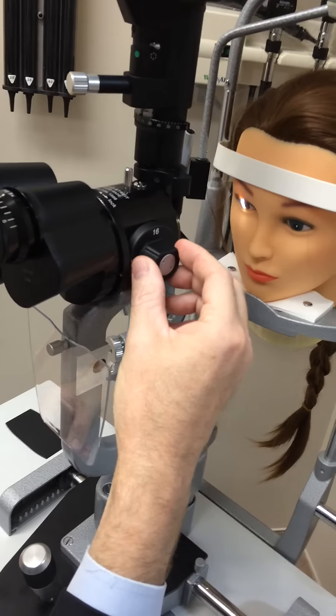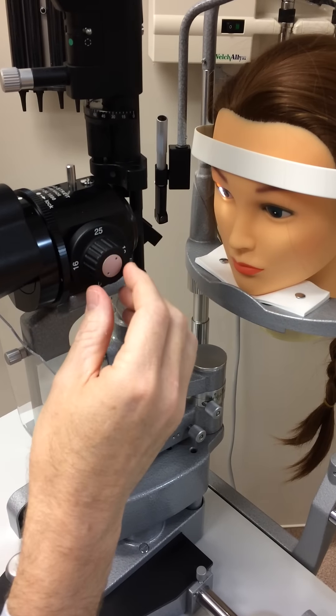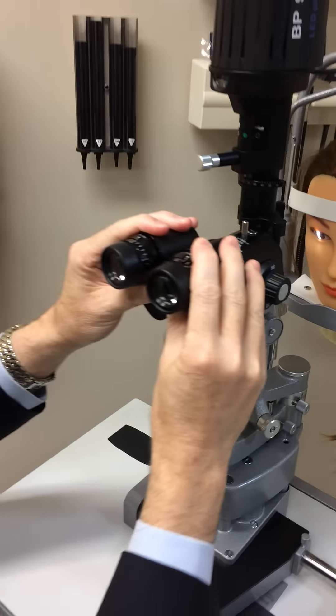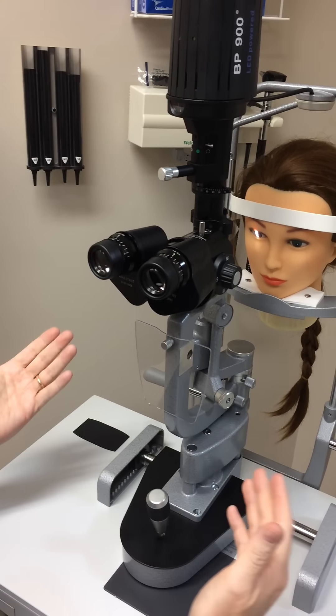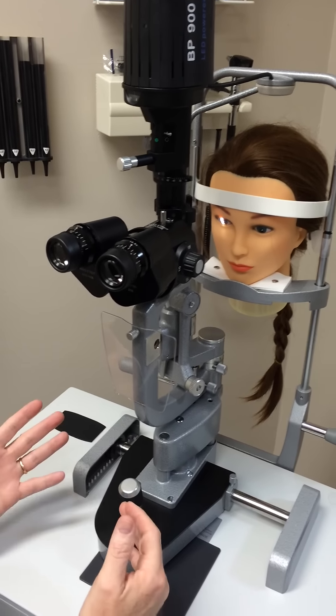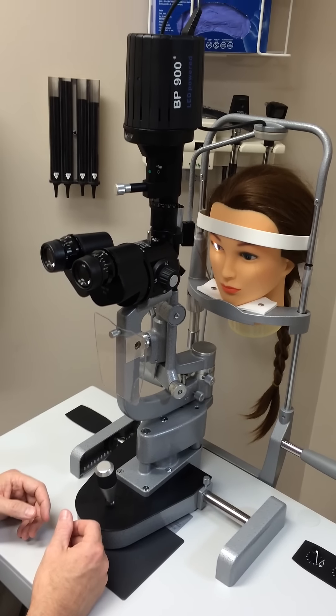If you want to change the magnification, it's right here. You've got 16, 10, and 25. So you can just change it right there. Obviously, adjusting the binoculars is right here. This is a brand new slit lamp — it's in room 9. There are the two old slit lamps sitting outside of room 10. Enjoy the lamp and please take good care of it.